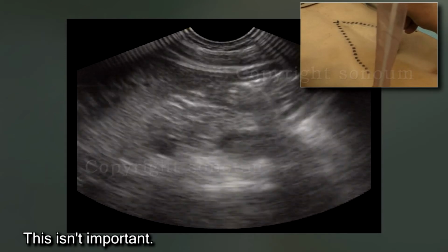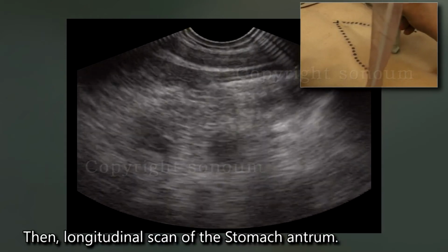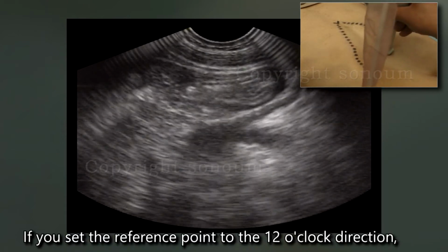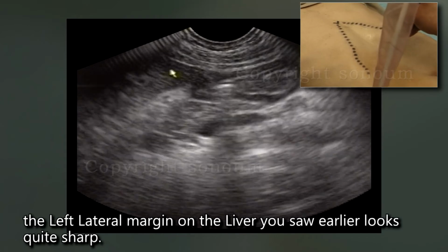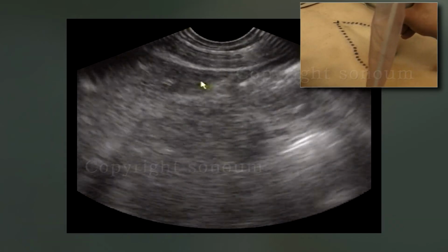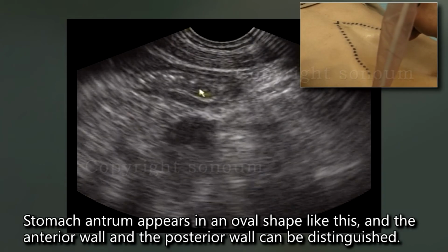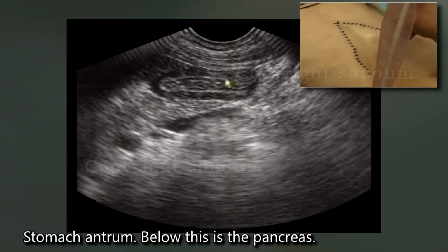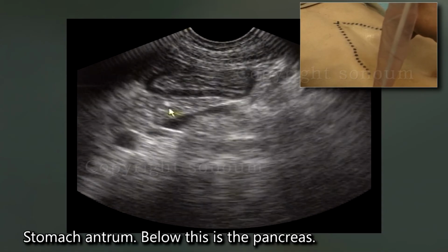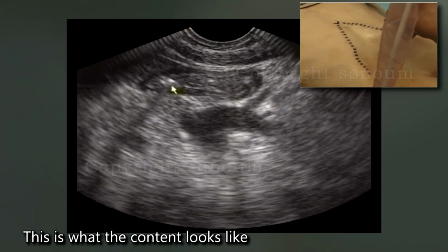Then, longitudinal scan of the stomach antrum. If you set the reference point to the 12 o'clock direction, the left lateral margin of the liver you saw earlier looks quite sharp. The stomach antrum appears in an oval shape like this, and the anterior wall and the posterior wall can be distinguished. Stomach antrum. Below this is the pancreas. This is what the content looks like.